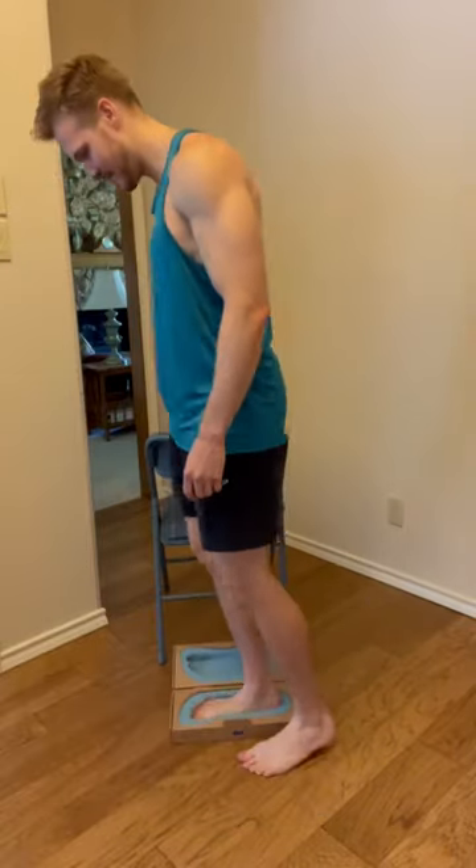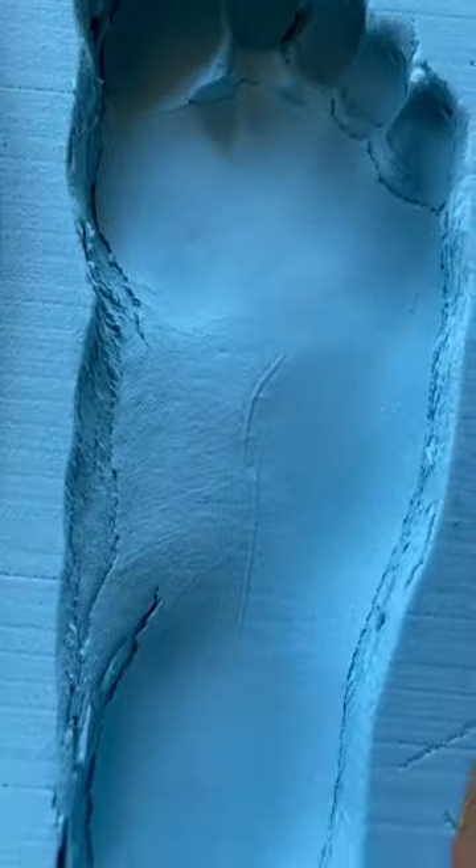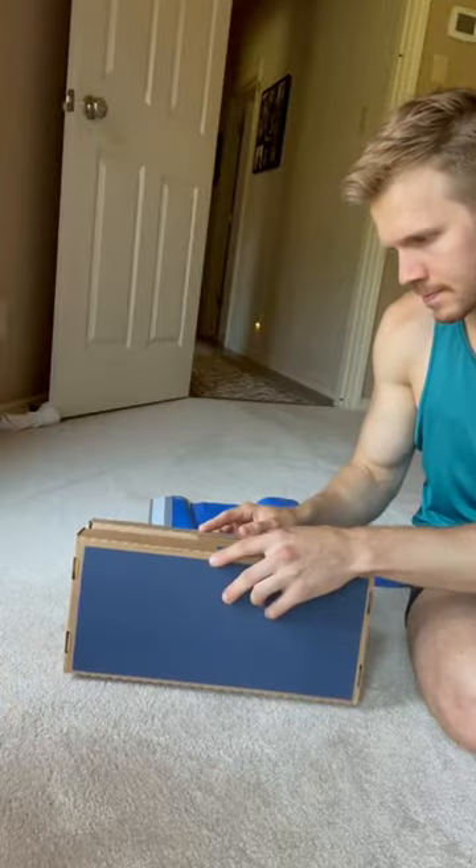A couple weeks ago, I shared my Upstep custom orthotics kit with you. Basically, I made imprints of my feet, I shipped it off, and just a couple weeks later, I received my custom orthotics.